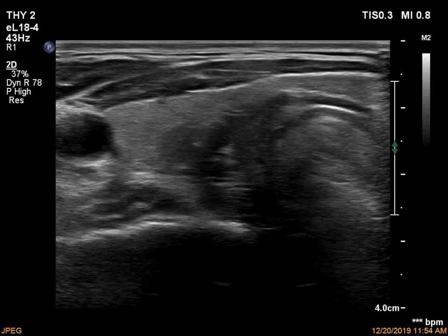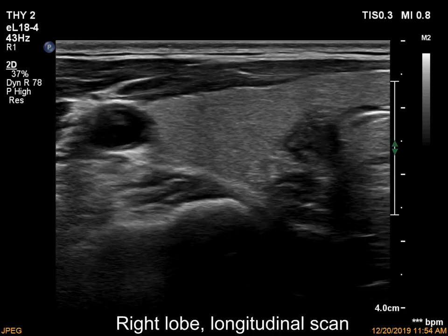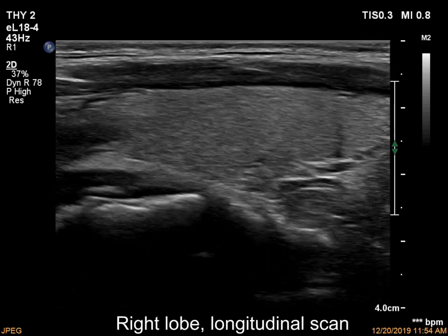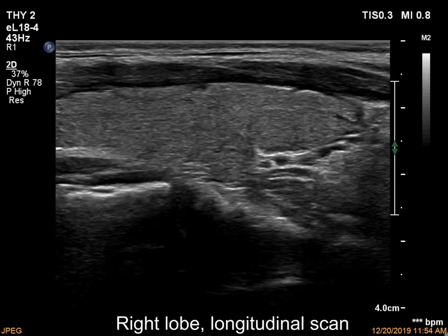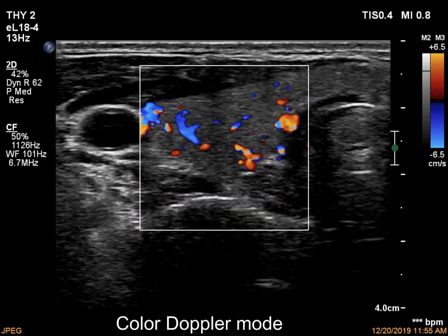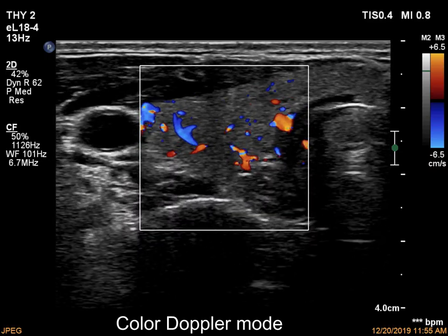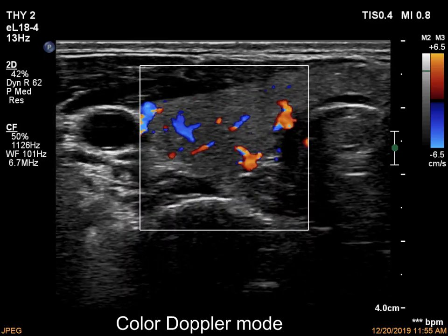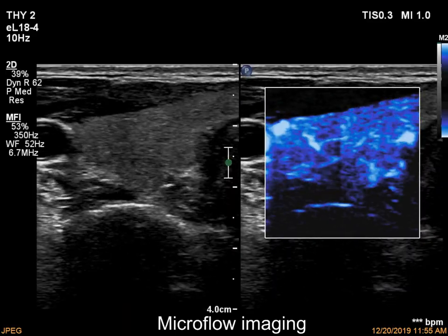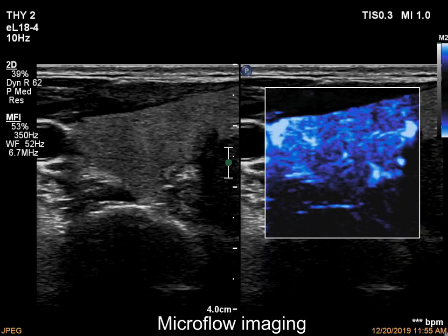The right lobe is ecnormal and has no discrete lesions. The vascularity is average or a bit increased. The distribution of vessels is even.